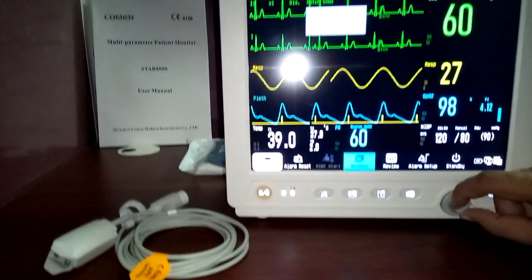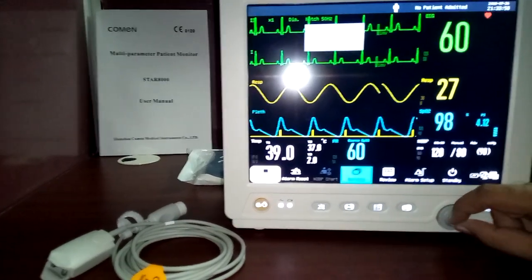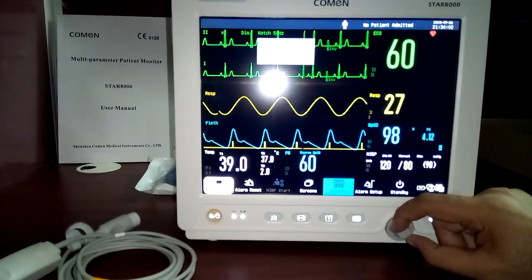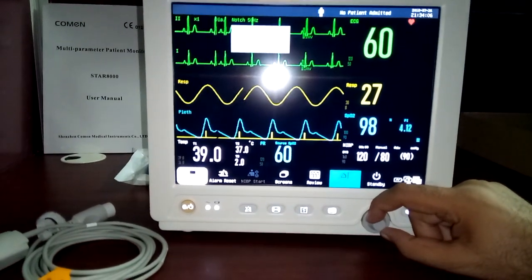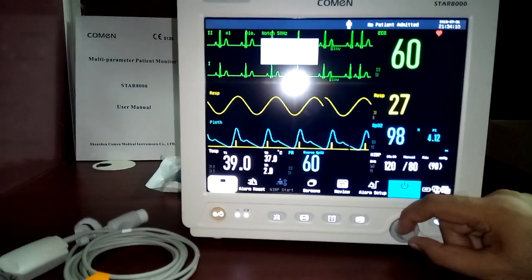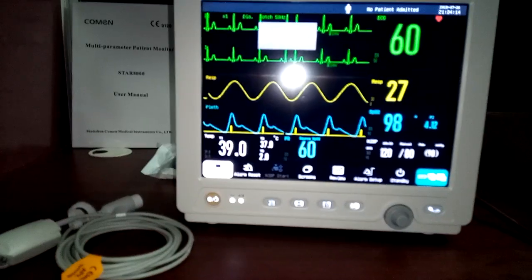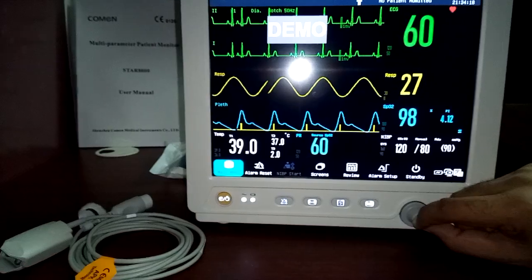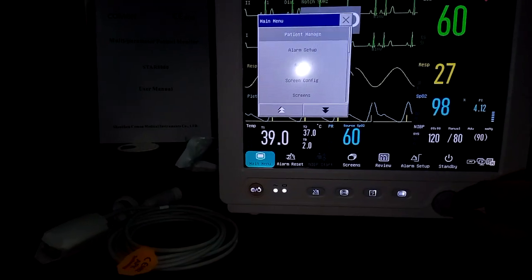In the main menu, you have alarm reset and NIBP start options. Under screen format you can change layouts. Under review, you can see all trends, table events, and alarm details. There is also alarm setup, standby mode, and a section for the central monitoring system. Let's go through the main menu options one by one.